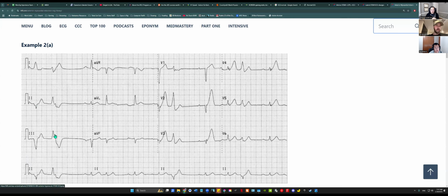Technically, this is not a good quality EKG. If you handed me this, I would say, take it again, only because I can't read 1, 2, and 3. You really just need to offset by a few more seconds, and then you'll get usable information.